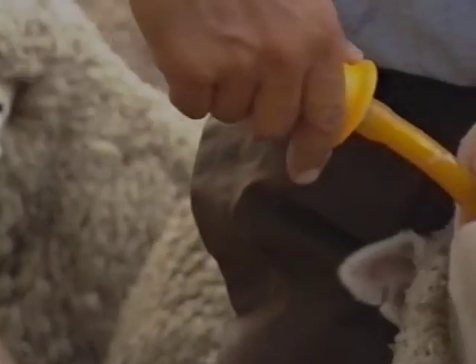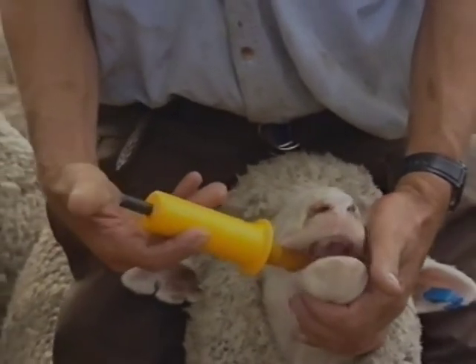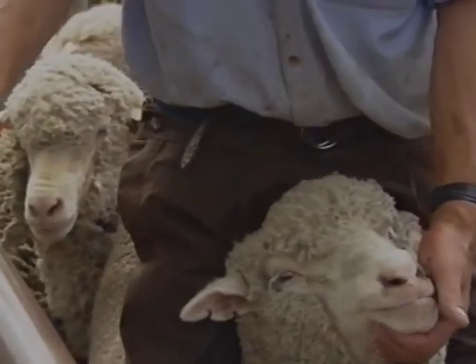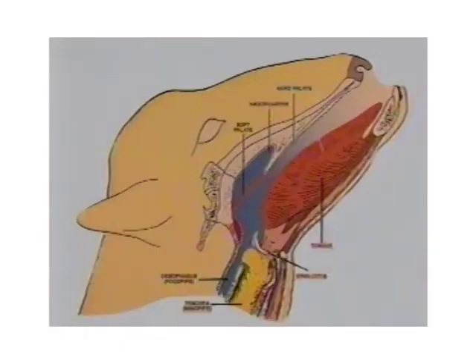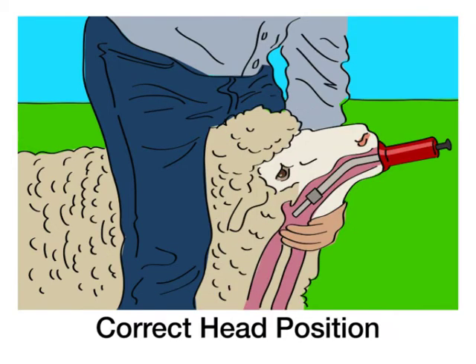Insert the capsule and applicator barrel at the side of the mouth. The sheep will start swallowing. Avoid the teeth, as biting the capsule could cause damage that would affect the performance of the capsule. Slight resistance may be felt as the sheep uses its tongue to block the capsule at the back of the mouth. Allow the sheep's swallowing to draw the capsule and applicator over the tongue and into the back of the throat. If you feel more than slight resistance, or if the sheep is not swallowing, withdraw the applicator, check the angle of the head and neck, and again slide the capsule and applicator over the tongue.